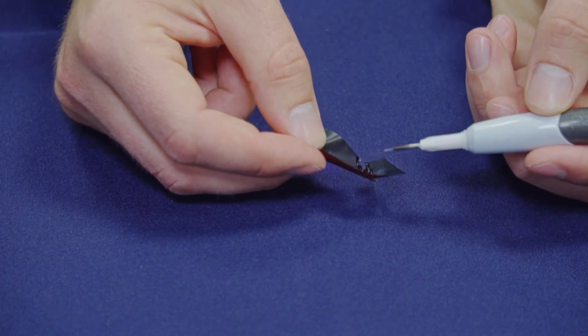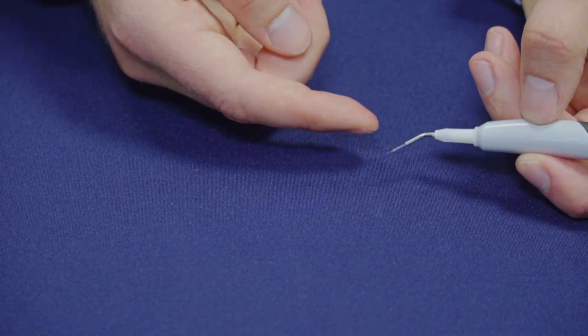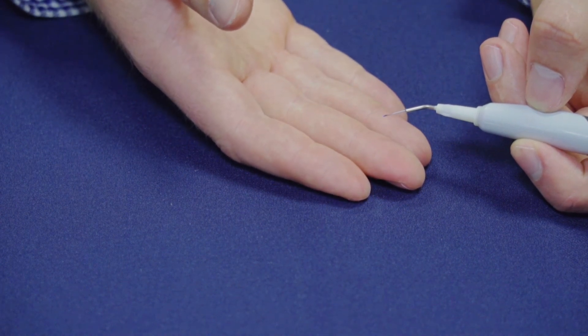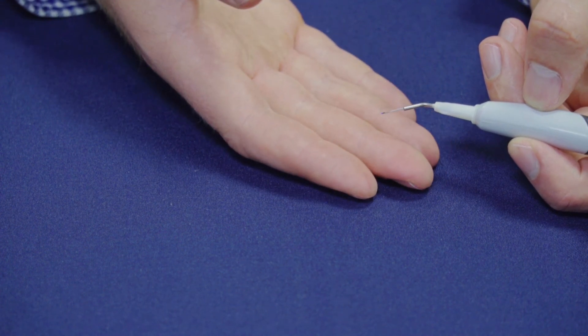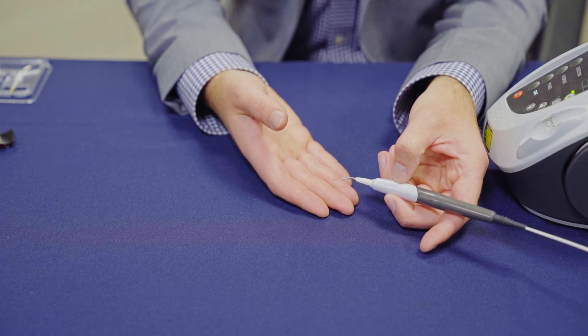You'll see it starts to activate and begins to cut the paper. Now you'll notice that the end of the tip is black. This will allow you to cut or ablate tissue, and you're going to want to use an initiated laser tip for any of those procedures. For a list of additional procedures that require an initiated tip, please consult your DFU.